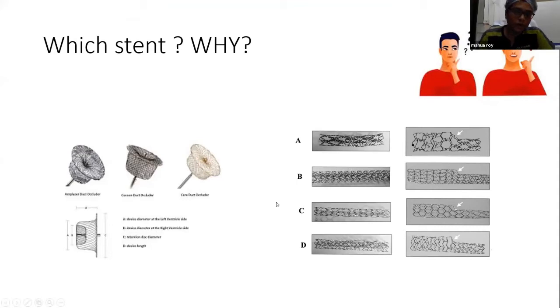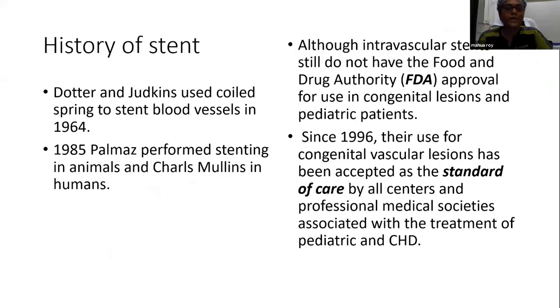We pediatric cardiologists are fond of devices. We know A to Z of devices. But adult cardiologists who are dealing with coronary intervention, they know stents better than us. Normally, we choose a stent because we have seen our seniors choose that stent in that particular position. So today I would like to throw some light on the basics of stents so that you can choose your own stent.